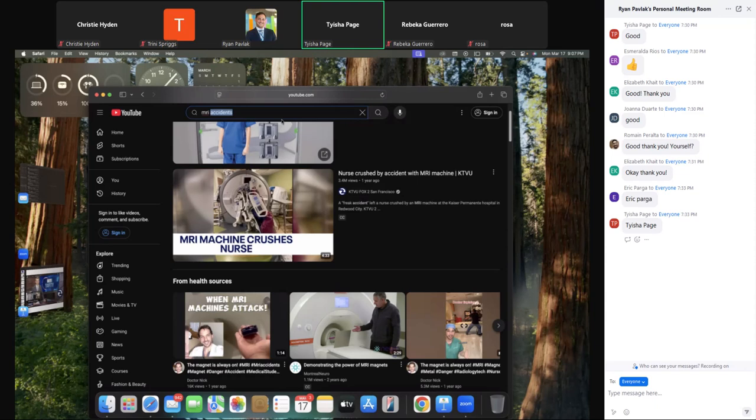Scary. Yeah, it's one of those things where, working in the mobile environment, we didn't necessarily screen this way. At my facility now, we have 3 devices that a patient goes through before they enter into the room. We've got the handheld unit like you would see at a sporting event or the airport where they'll wand.